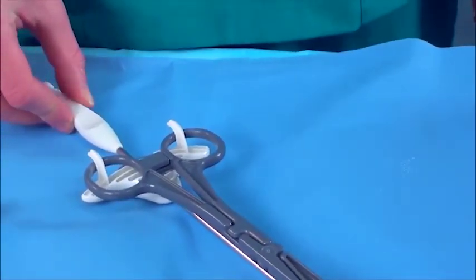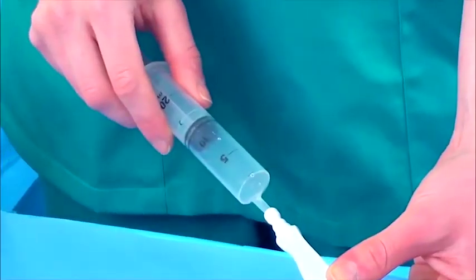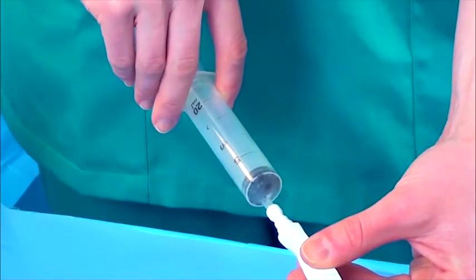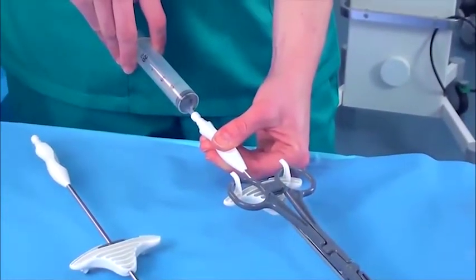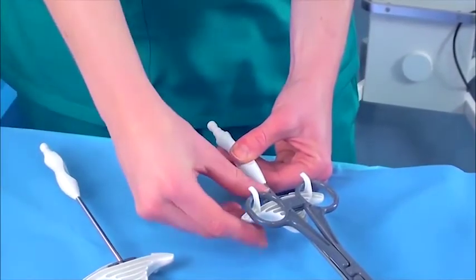Now the instrument is in place, it can be used to manipulate the position of the uterus by moving the handle, and dye can be injected with a syringe into the lower connection on the handle to check tubal patency. Finally, to release the instrument at the end of the procedure, simply press the lever to move the clamp towards the patient.